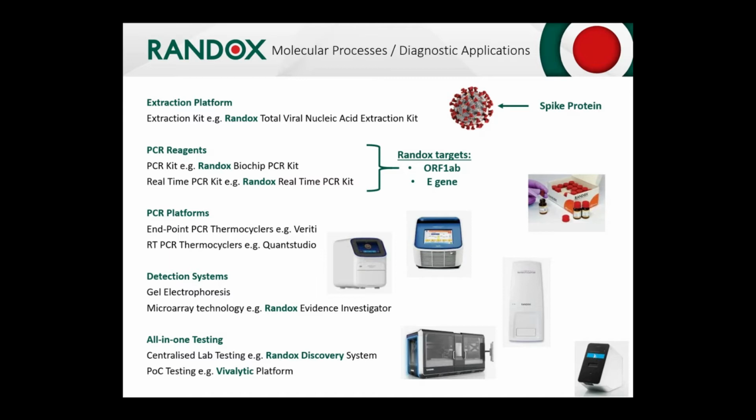And you will either receive a result on the patient diagnosis during the amplification process in real time, or at the end of the process of the PCR, such as endpoint. And if you are using endpoint analysis, then you will have a subsequent department within your lab that will be responsible for the detection. So, for example, within the Randox lab, not only did we use real-time PCR, but we used biochip array technology, which is Randox technology.